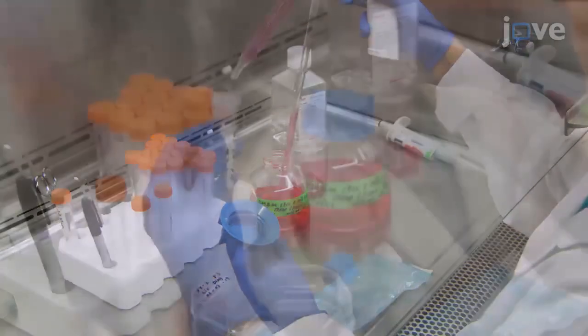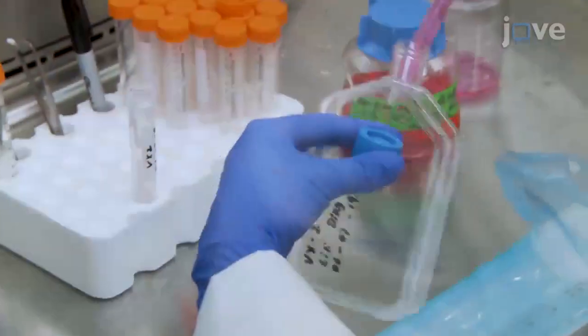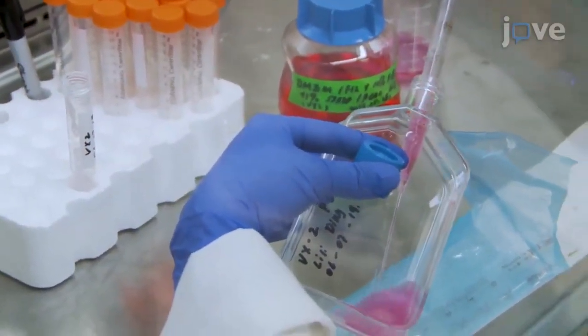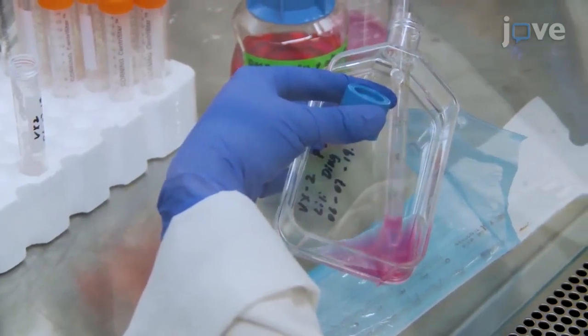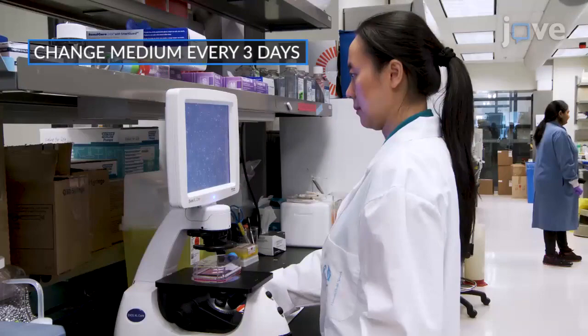Resuspend the pellet in 9 milliliters of medium. Transfer the cells to a large culture flask for incubation at 37 degrees Celsius without shaking, checking the cells daily for confluence by light microscopy.